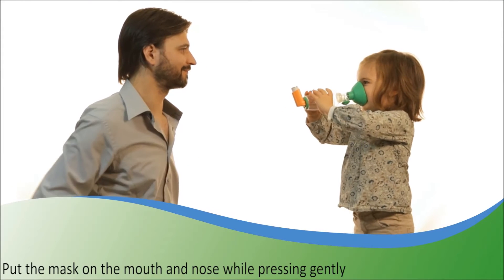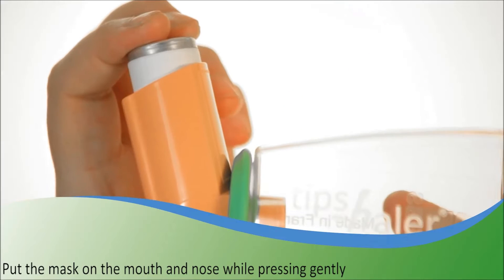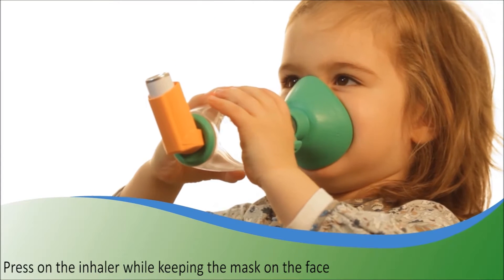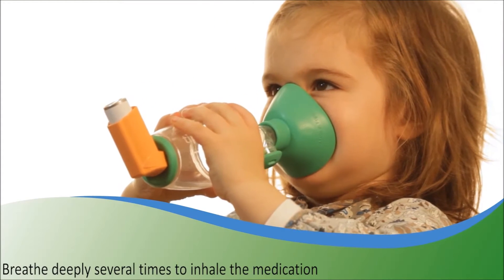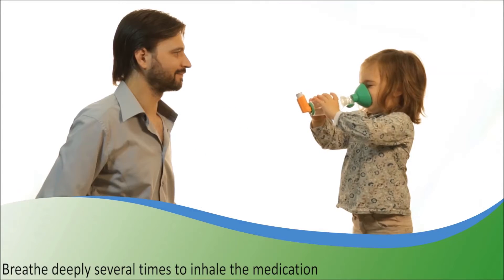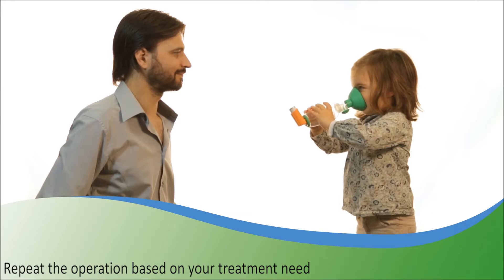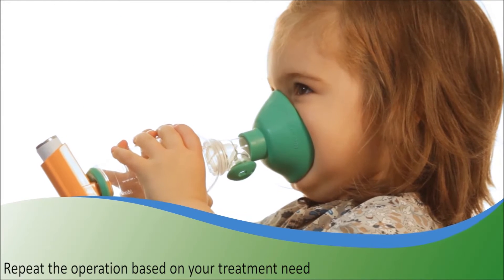Put the mask of Tipshaler on the mouth and the nose and press gently to form a good seal. Press on the metered dose inhaler to release a puff of drug. Let the child breathe five to six times. If necessary, repeat the process according to the physician's instruction.